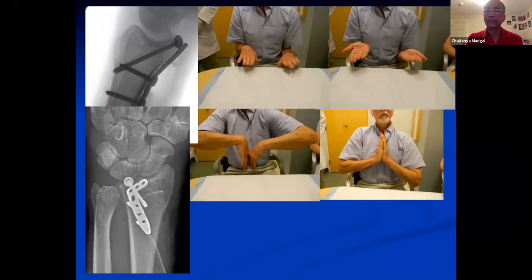Do you think that's a reasonable radiographic restoration? I do — even though the fluoro image is there in the lateral, you've restored that teardrop angle. Think about the perilunate assessment — the C-shape of the distal radius should parallel the C-shape of the lunate. You've got a nice compression screw with a one-hole plate plus a buttress with an anti-glide effect to keep that fragment from collapsing proximally.